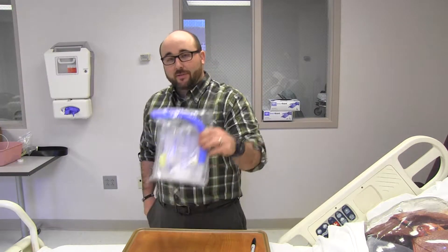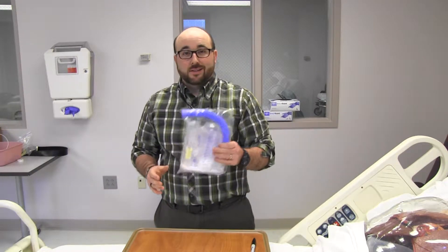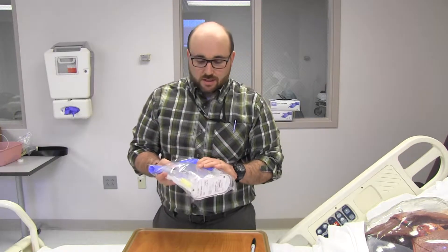Alright, now I'm going to show a little bit about the incentive spirometer. Everybody's seen them, but I'm going to give the respiratory therapist a way to set it up and teach it to your patients. So this is a standard incentive spirometer device. They all do pretty much the same thing. I'll give you a couple of helpful hints with them.